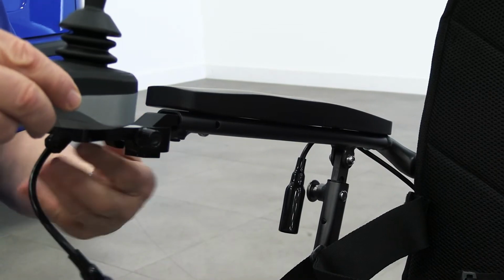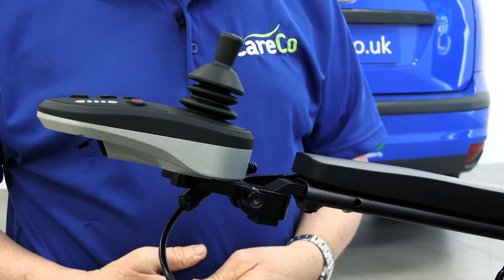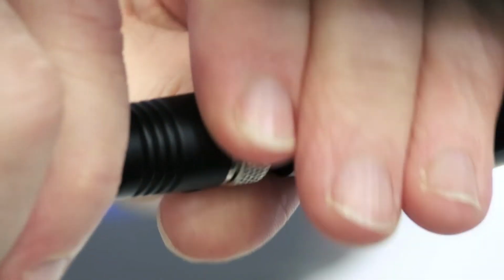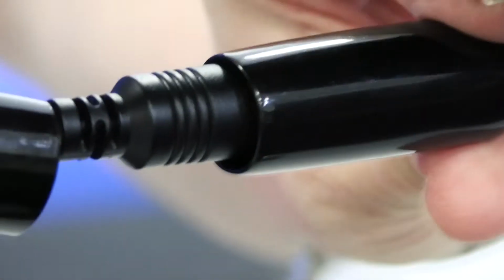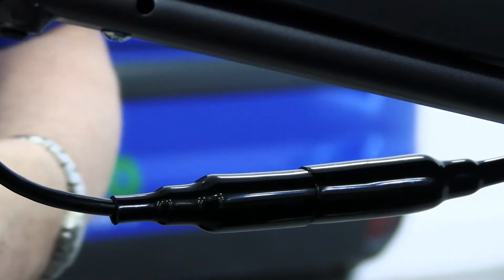Attach the controller to the armrest using the pin on the side to secure it in place. Plug the control panel cable and the extended cable together. Then rotate the lock ring to secure the cables together. Please use the plastic covers to protect the plugs.